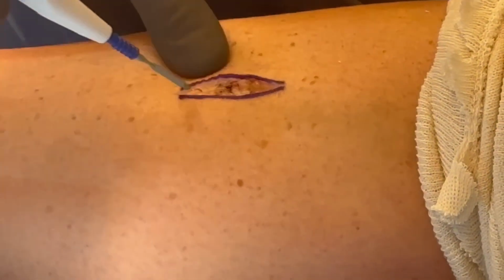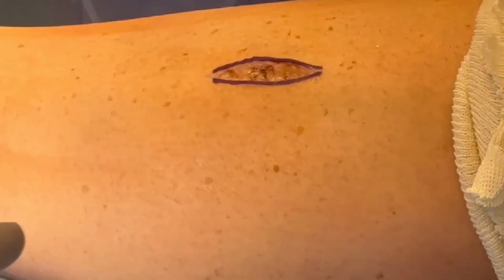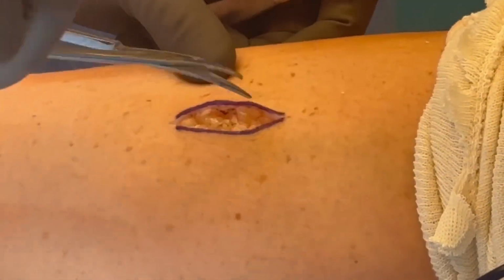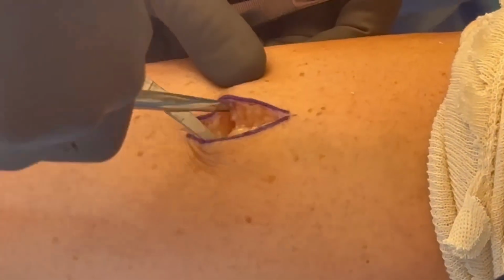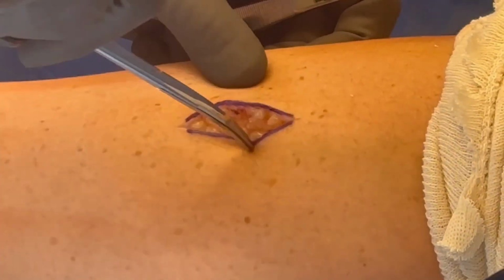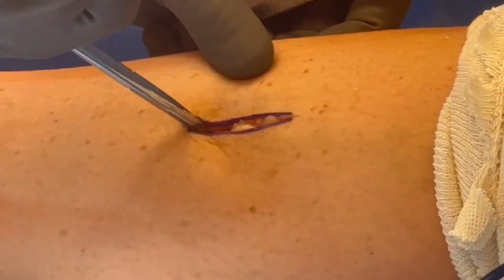I like to use a 10 blade and I go through the skin and superficial fascia and ligate any vessels as needed. Then I'm going to use a Metzenbaum scissors to undermine the soft tissue.